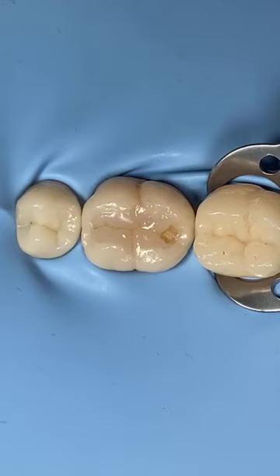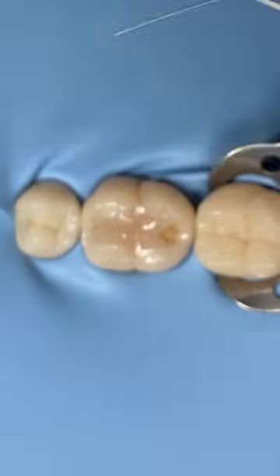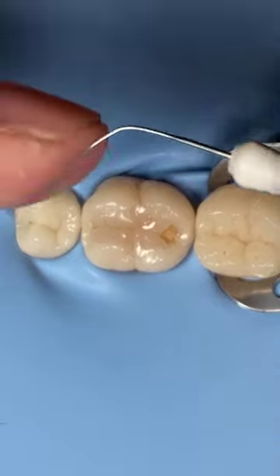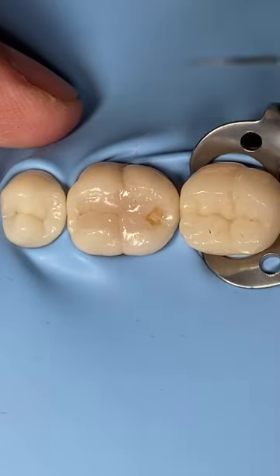There's a saying, you know: the important thing is the man behind the gun, something like that. But in my opinion, the gun is still important. So you have to pick the gun that suits you best. Don't ever trust the expensive one. Maybe with an expensive one I can create very good anatomy? That's the biggest lie. The best instrument is the one that you have and the one that you get used to. That's the key. I have been used to this instrument since I was in university.